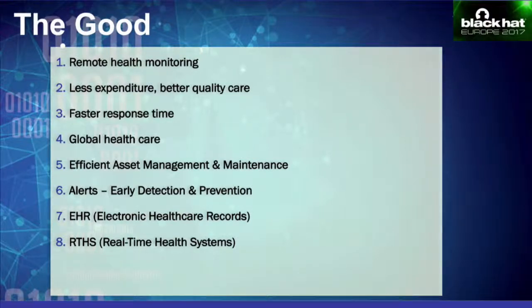Connected medical devices can also remind patients of taking medicine at a certain time, which could be a problem for some patients. And then finally, one of the most important, in my opinion, would be the EHR, which is electronic healthcare records systems, and real-time health systems. And so these systems collect real-time data from all these connected medical devices.